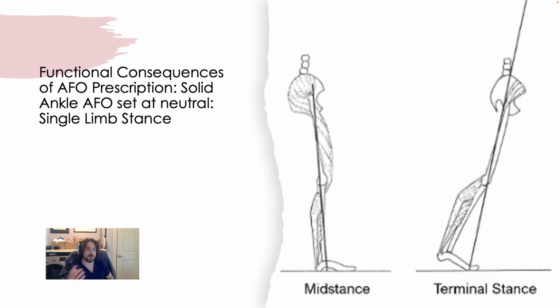So again here, our wedging is what really helps manipulate that ground reaction force vector at the knee. And we're just looking for that sweet spot between having enough stability to overcome any weakness that they have and having enough mobility so that way their gait is still efficient.